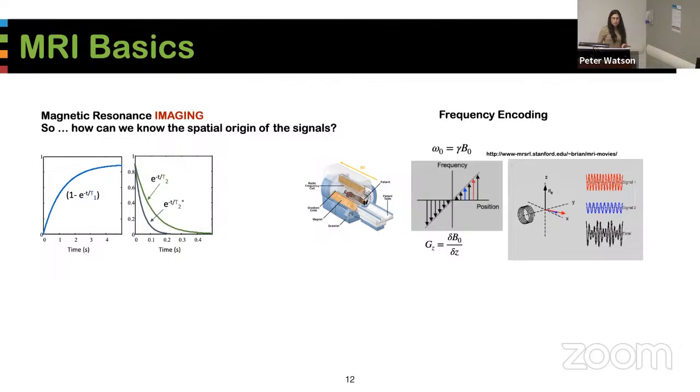And what we want to know, from this black signal that we measure, is how much there is of each different frequency. That may sound like something that you've learned in your classes. It's the Fourier transform that's going to tell you that information. If you take the Fourier transform of your measured signal, you're going to know how much of each frequency is present in your signal.